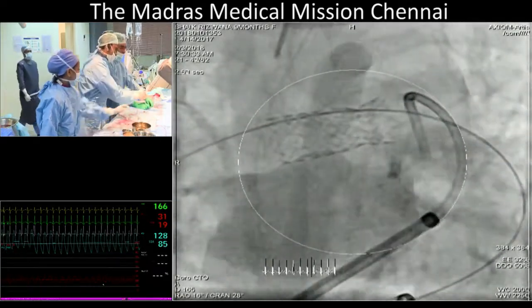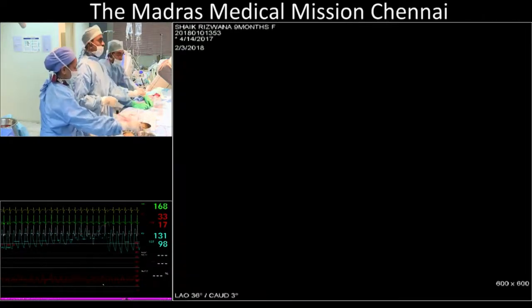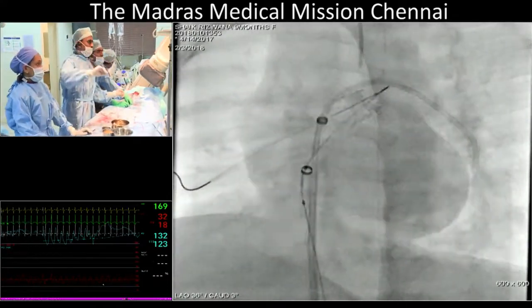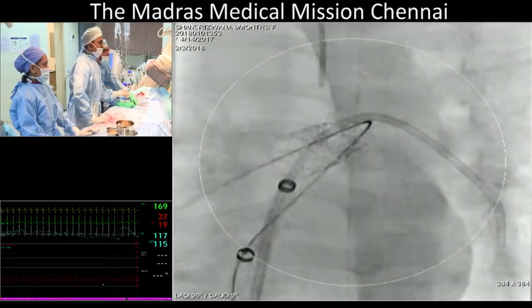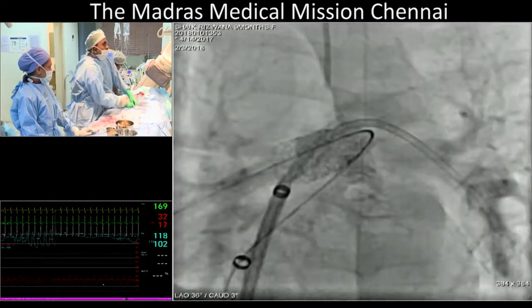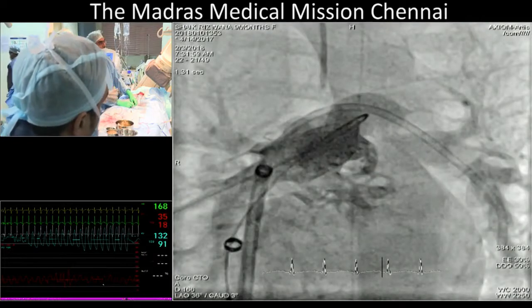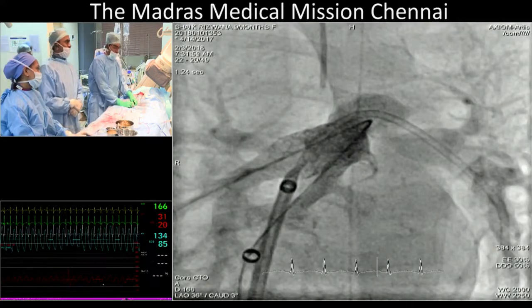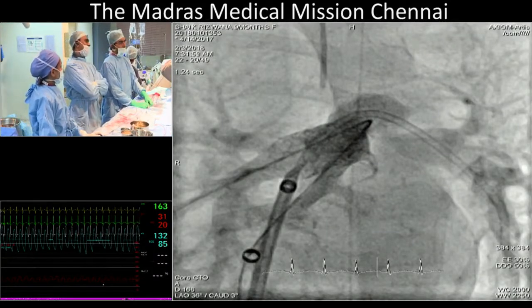I'll give you another picture. Just have a look at it. Shaq, I think that Williams. I have not had a good result. Zoom it now. I have not had a good result with just plain balloon alone. I'll show you. Freeze that. Just go back. Shaq, the ostium of that left pulmonary artery is looking less than half the hilar left pulmonary artery.